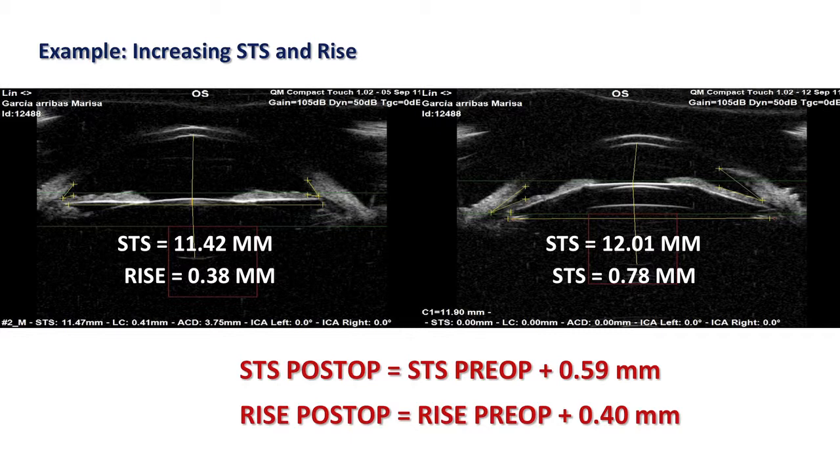In this case, 0.4 millimeters bigger. And this is because the lens gets more posterior than what we thought when we placed this gate over there. So really, if we want to try to mimic what will happen after surgery, we should have put this gate more posterior. But of course there is the ciliary body, so you put it here where you see the end of the sulcus to sulcus fornix.